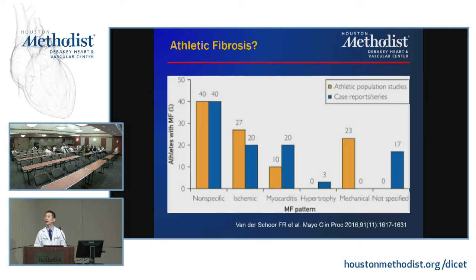Like less than 5% usually, or do you think it can be larger? That's a good question. From what I've seen in the case literature, it can vary all over the place depending on what's studied. We've had an individual referred with this, an athlete, but there were concerns about a cardiomyopathy. CMR showed fibrosis, I think, somewhere around 3 to 5%. Unfortunately, it's nonspecific, and it can be in any place, not just the RV septal insertion sites. Is that right? That's correct.